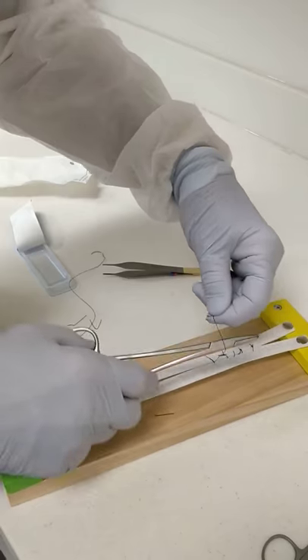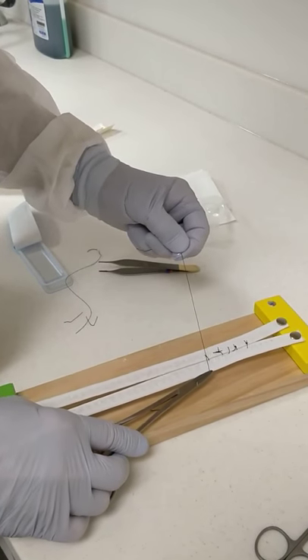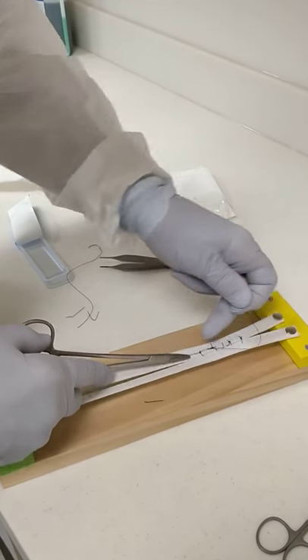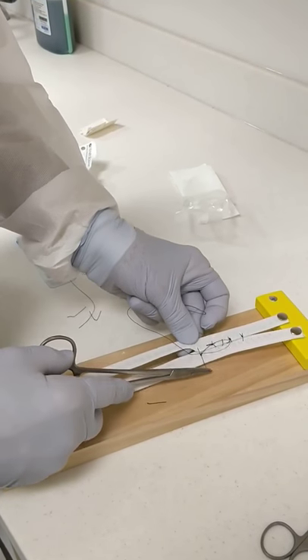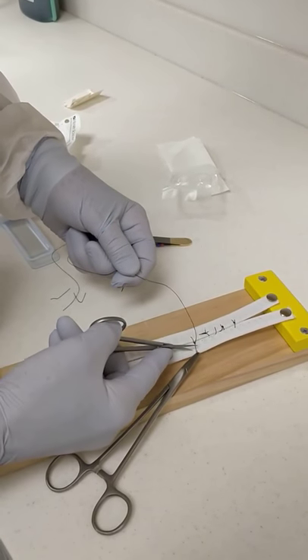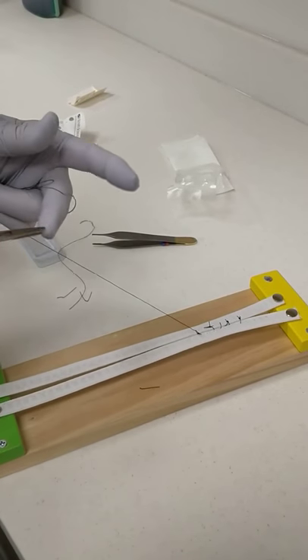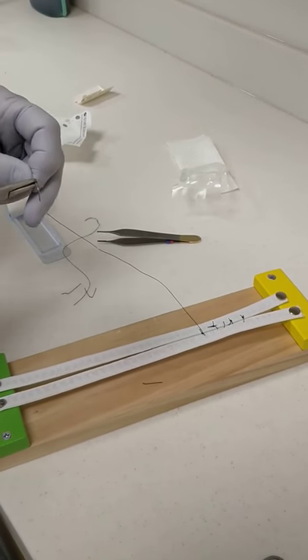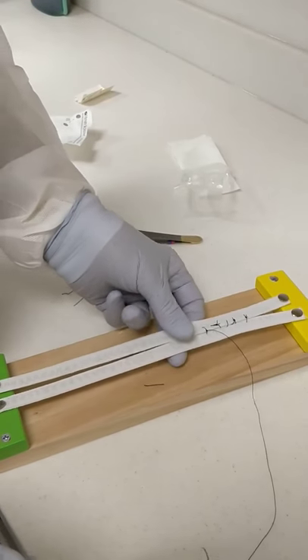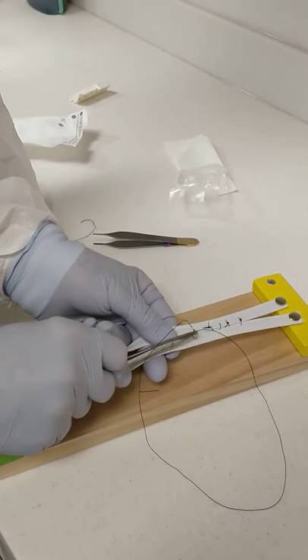Now, I've got control of my suture. Let me tie this. Now, you're not going to be on one side.